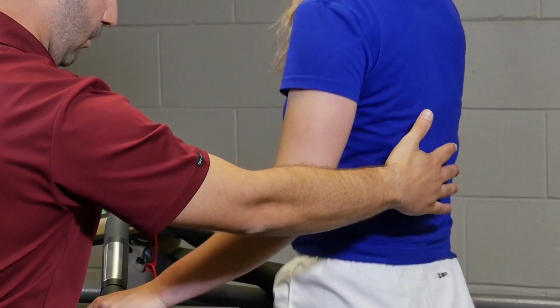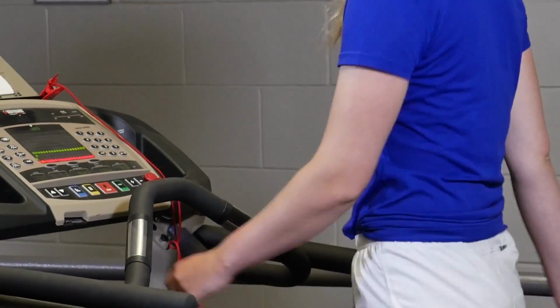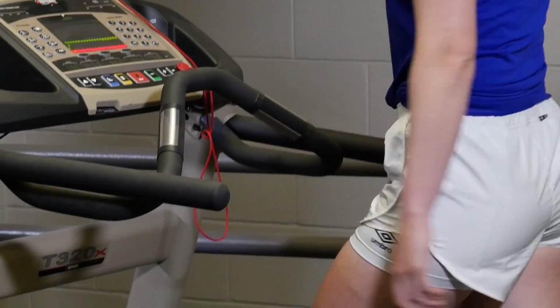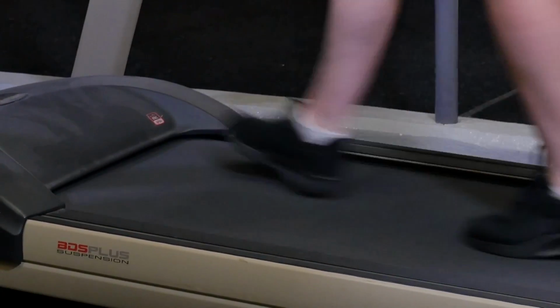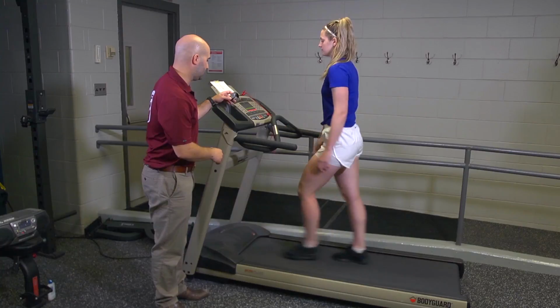Once she's comfortable with that walking speed, I can instruct her to release the handlebars, and I would start my stopwatch, and the test has now begun. So once again, this is a 4-minute warm-up stage. This is the speed I've selected. Based on her heart rate, I might choose to increase or decrease the speed.